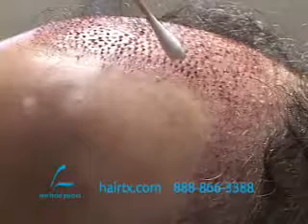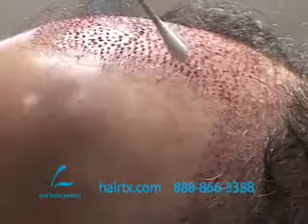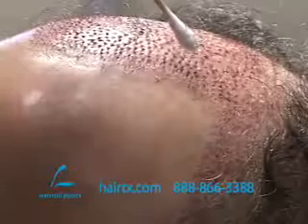And what we've done is carry that concept all the way forward, almost to the hairline. When you're at the hairline, you don't want to do that. We use very, very small slit sites, sagittal slit sites. But as we go back about a couple centimeters, these are micro punches that are 0.75 millimeters. So you can imagine extremely, extremely tiny. But again, being able to do almost a one-to-one, if not a little bit more favorable than one-to-one, exchange of bald scalp. And then staging that back, going into a 1 millimeter punch graft removal of bald scalp, and then going back into the central density corridor of 1.2 millimeters.